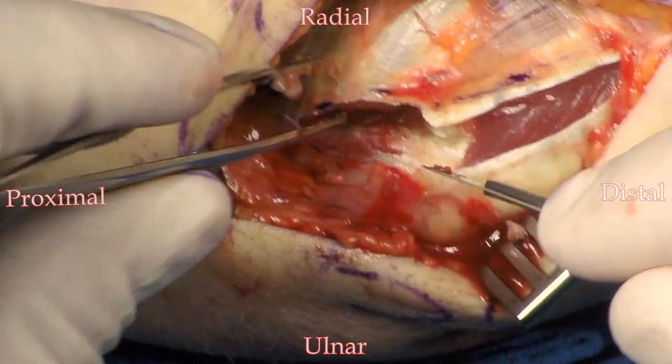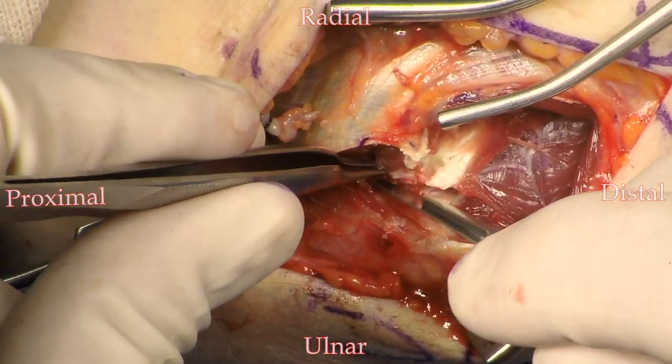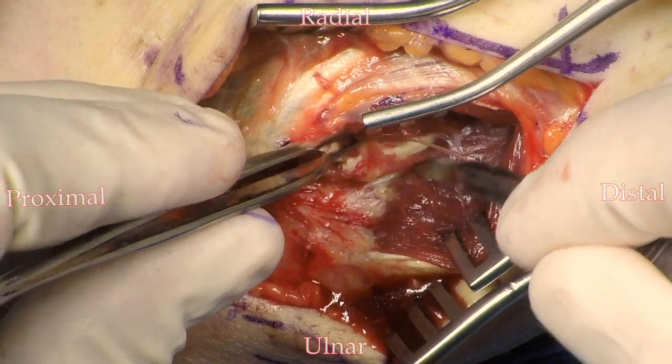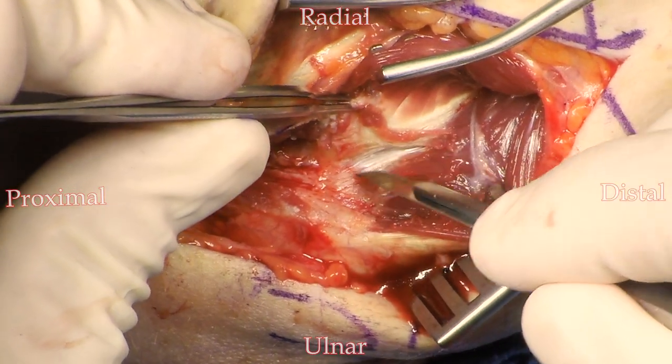I do find it easier to start the dissection on the supracondylar ridge, on the left of the screen. Bring the dissection over the anterior aspect of the distal humerus, then drop into the joint, and from there you can take the dissection distally.